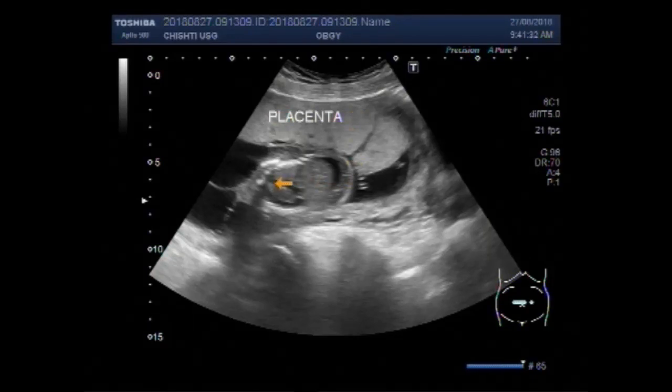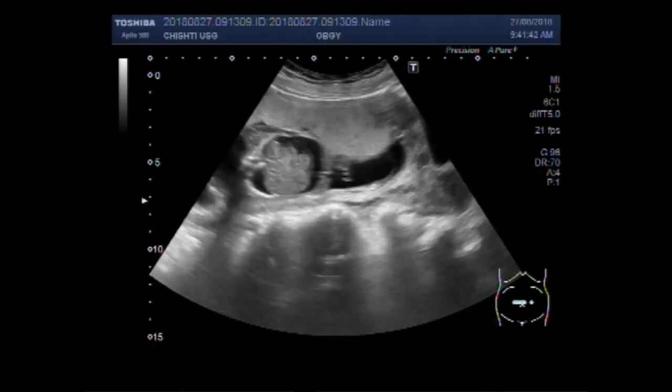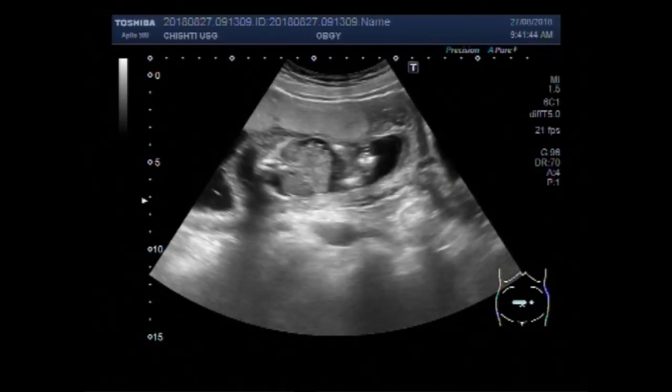This is the fetal abdomen having ascitic fluid. This is fetal ascites.